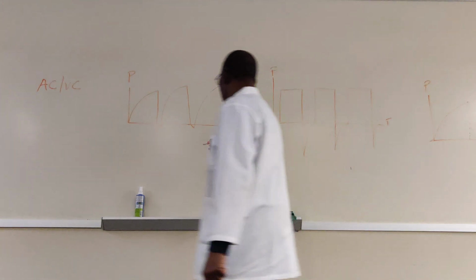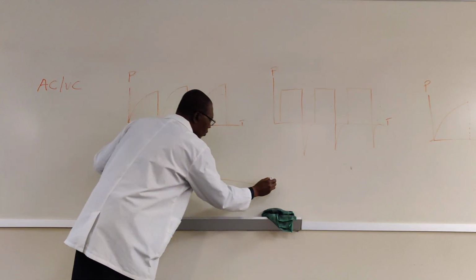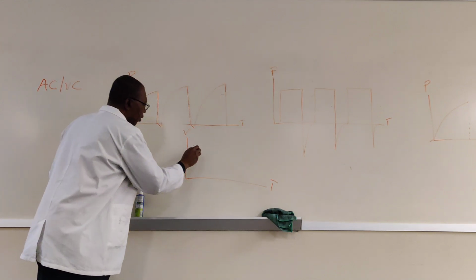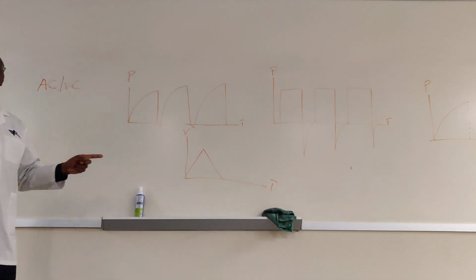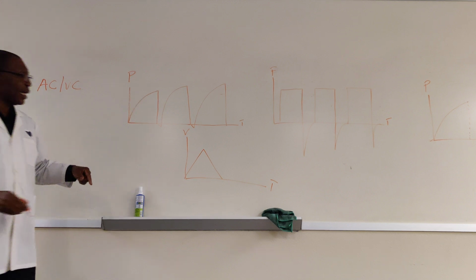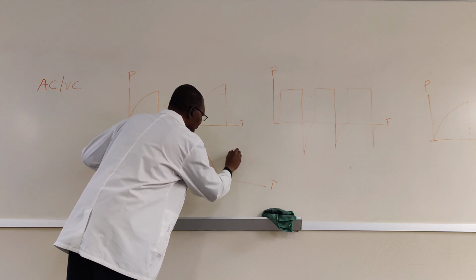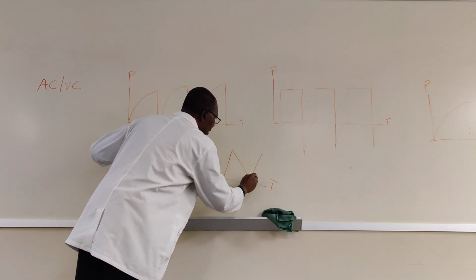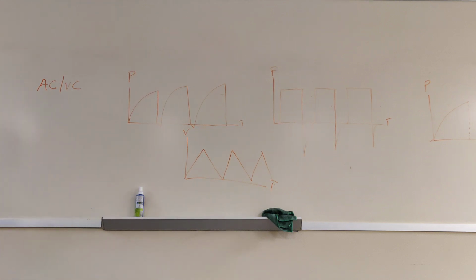And then the volume time curve for that is going to look like this. Remember, we're controlling volume, so the volume will be the same. The exact other one will be about the same, so they will be of the same height, kind of like pointed. So if you set your patient on the AC VC mode and you're looking at the scalars, that's exactly what it's going to look like. Any questions about that?